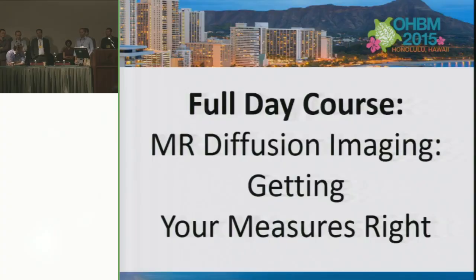I think it's been pointed out that calling it white matter integrity is really kind of a misnomer. As we've seen, many different things can affect FA, if the fibers are more dense or there's injury. So I think it really depends on, again, what your question is. And there's no way to interpret FA without some other context or some other information.